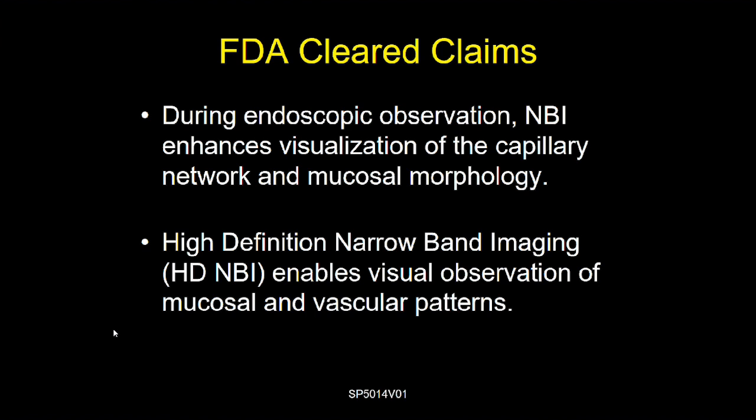When we get started, I want to just mention some of the FDA cleared claims for this technology. During endoscopic observation, NBI enhances visualization of the capillary network and mucosal morphology. In addition, high-definition narrowband imaging enables visual observation of both mucosal and vascular patterns.